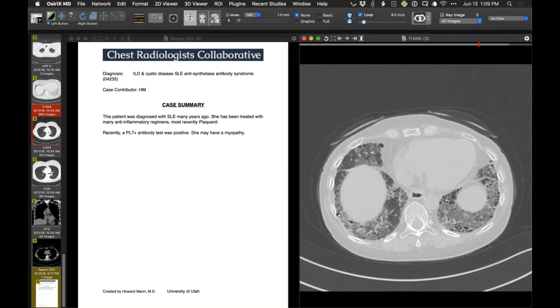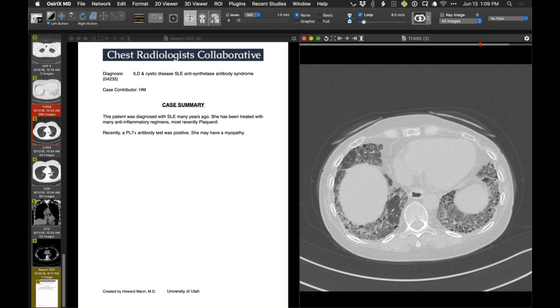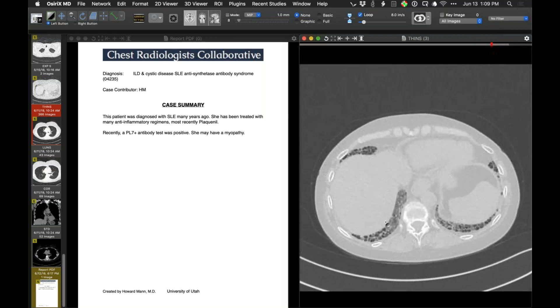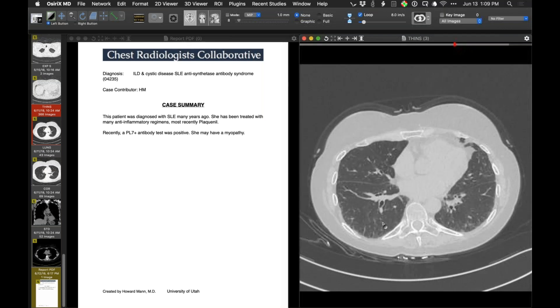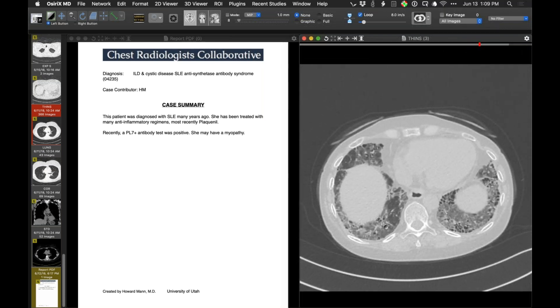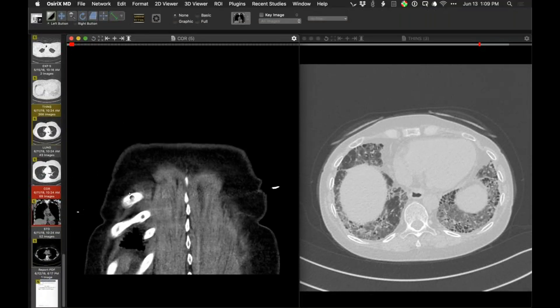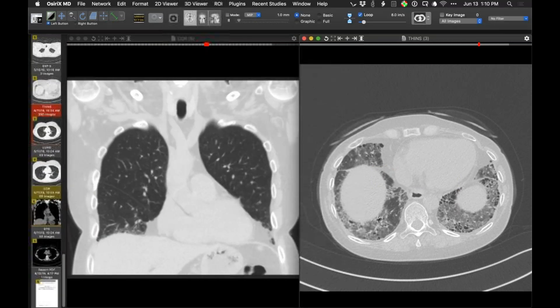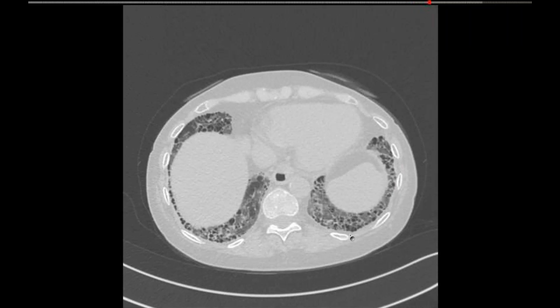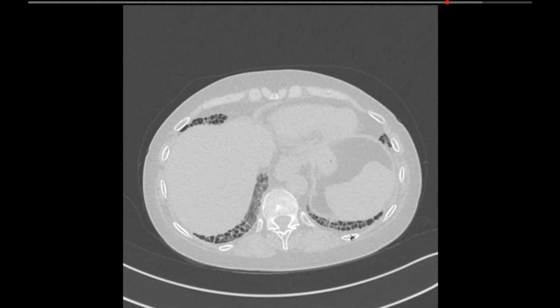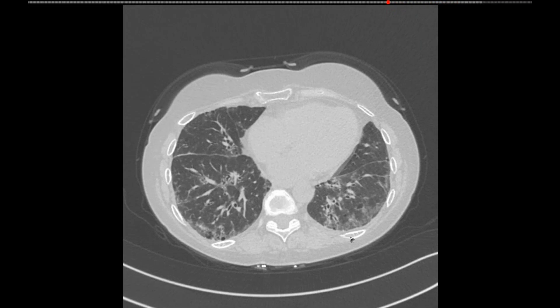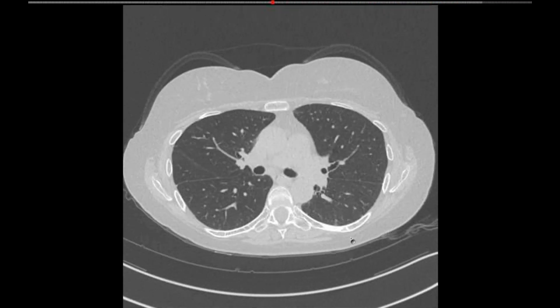We can see cellular interstitial pneumonitis and organizing pneumonia as findings in antisynthetase syndrome. You can call it connective tissue disease-associated ILD — that's what our pulmonologists are calling it. I've seen cystic spaces in some scleroderma patients too, not to this extent, but it's clearly not honeycomb cysts in the sense of UIP and not dilated airways. CTD-ILD seems to work as a label.